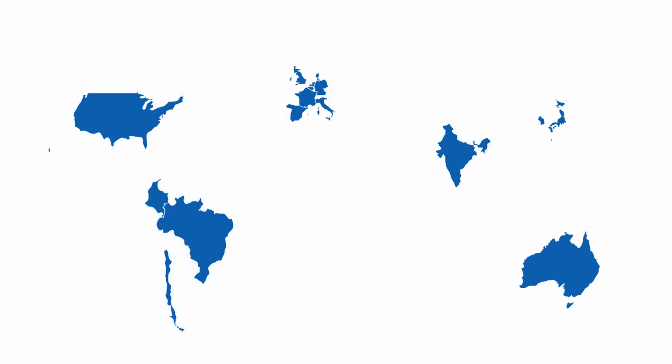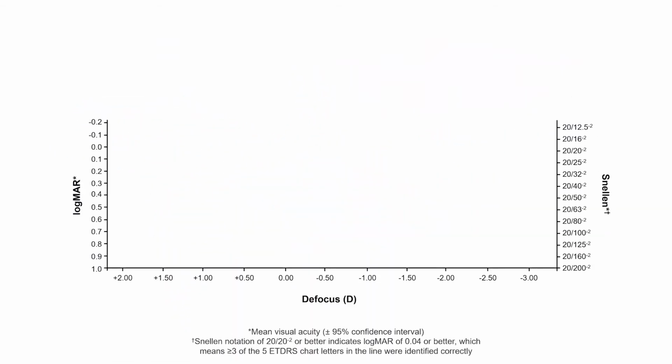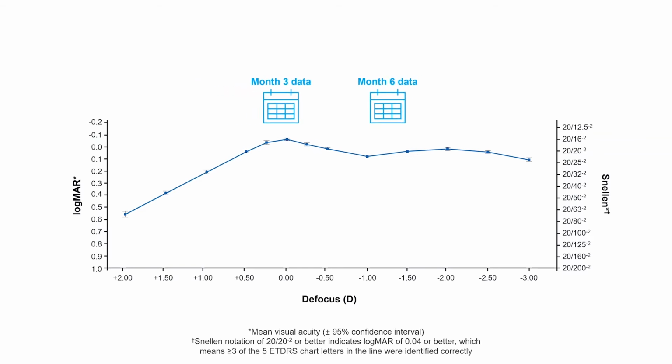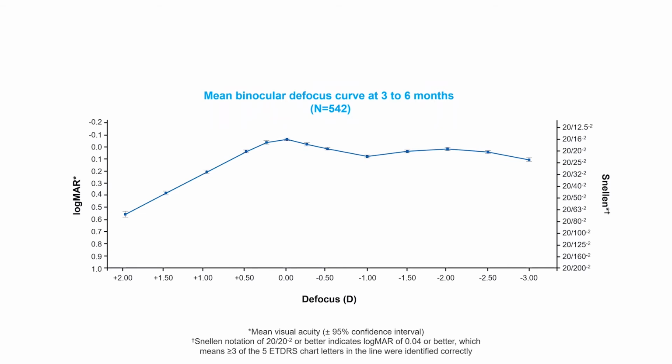Because similar methods were used in each study to assess visual outcomes, we were able to pool all of this data, thereby providing a better understanding of how the trifocal IOL TFNT00 performs amongst a global population. Due to variation in time points at which outcomes were assessed, and to provide the greatest sample size for this analysis, visual outcomes were pooled for the 3 and 6 month time points. This approach was made possible by the refractive stability displayed by TFNT00 at the month 3 postoperative visit.